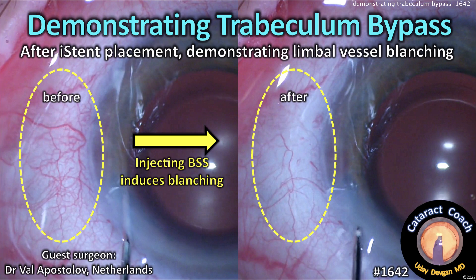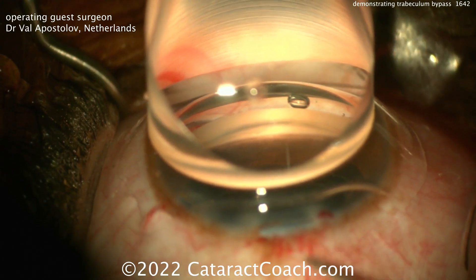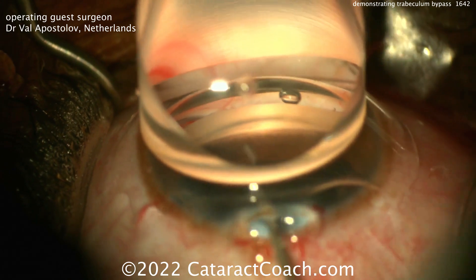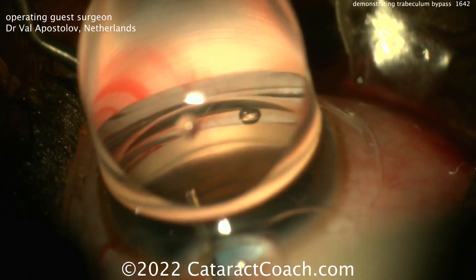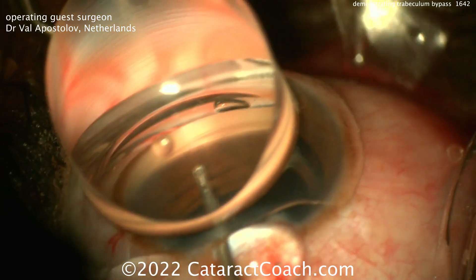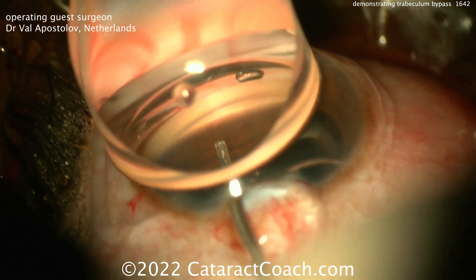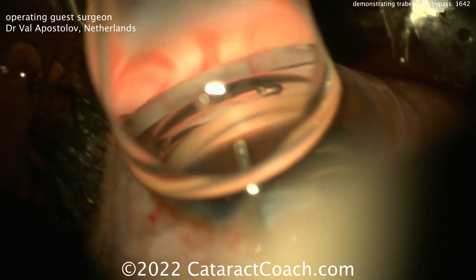CataractCoach.com, demonstrating trabeculum bypass. This is after an eye stent placement — you can demonstrate blanching of the limbal vessels. Our guest surgeon here is doing the new eye stent, and this is a gonio prism on top of the cornea. The eye is tilted away from the surgeon, the microscope is tilted towards the surgeon to get this view. You can see good visualization of the angle and bringing the insertion device close to that trabecular meshwork.